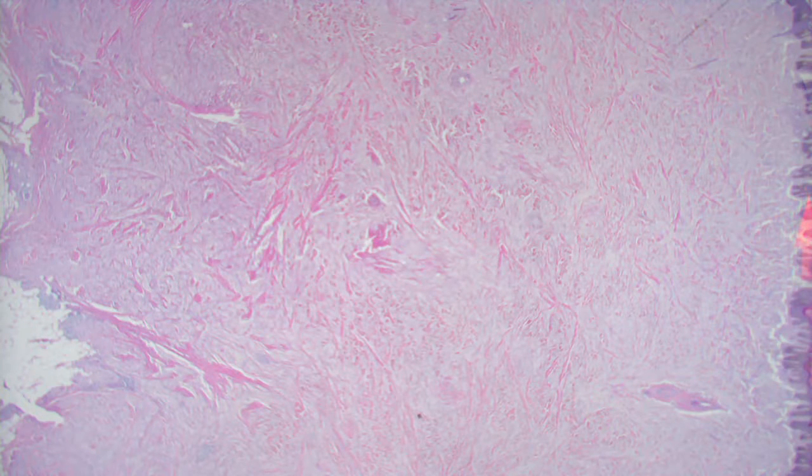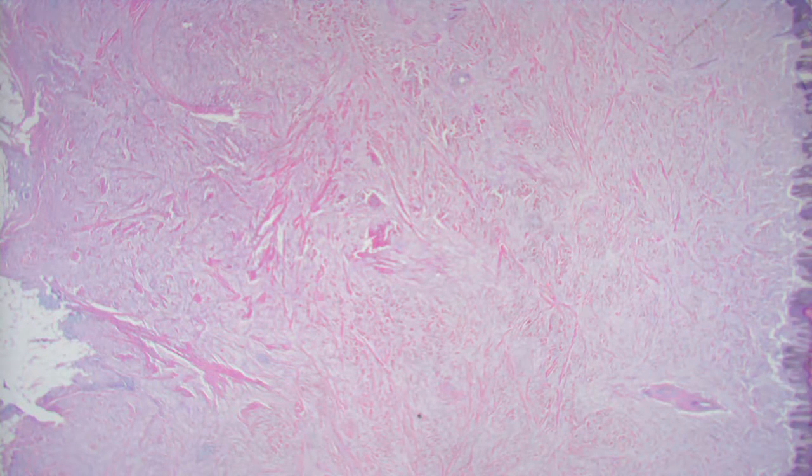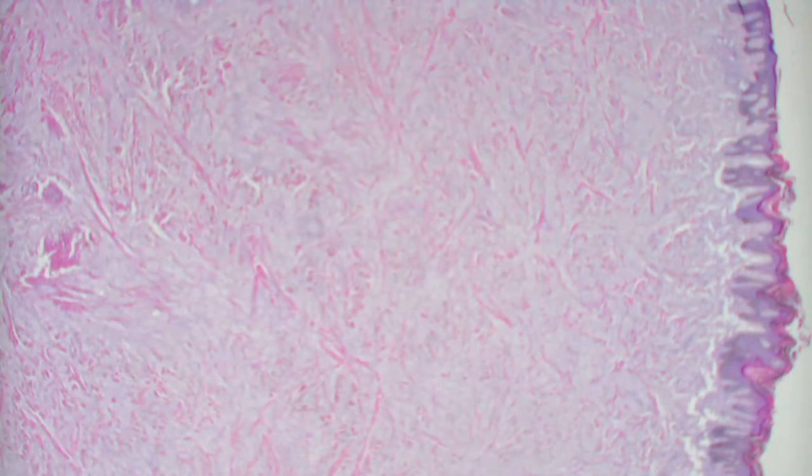What color are these cells? It's kind of purple, blue-ish. Well, this is more purple. Purple, okay. But what about this? Pink or light, kind of clear at low magnification, isn't it? So here's some stroma that's pink, and these cells look kind of clear because they've got a lot of cytoplasm. Did you think this was epithelial or non-epithelial? Non-epithelial. And if it's epithelial, it's a different type of epithelium, isn't it?